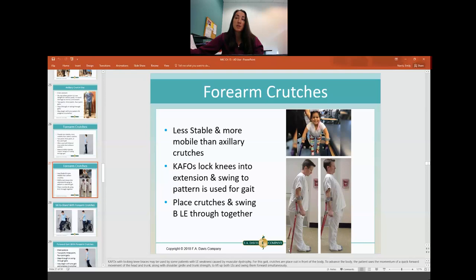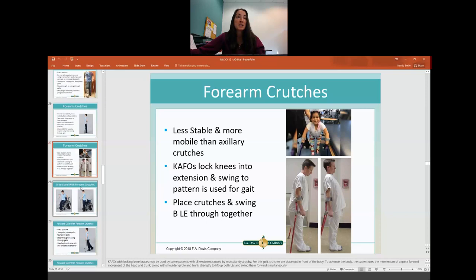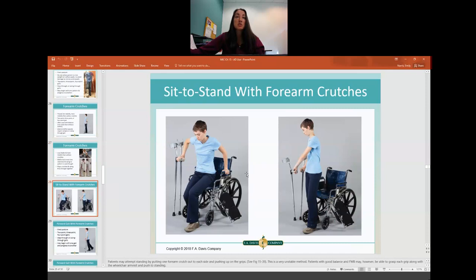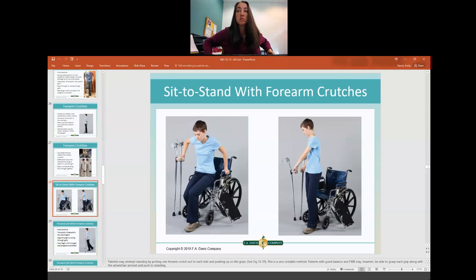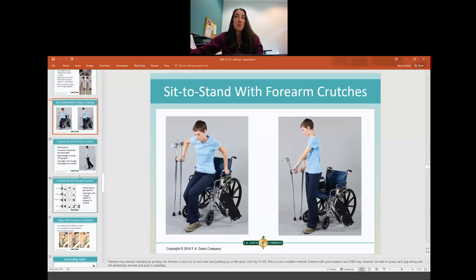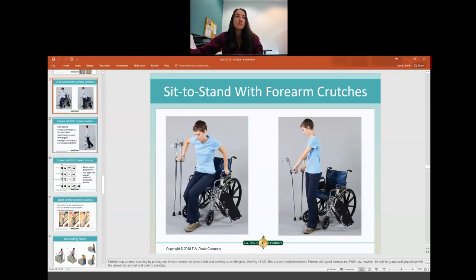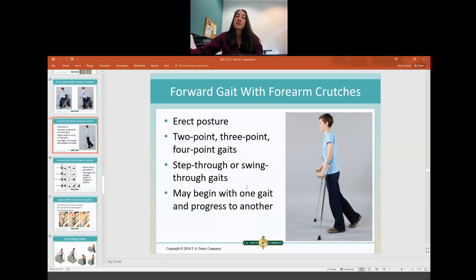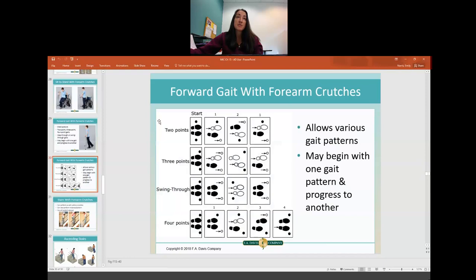With swing-to or swing-through gait, you set the crutches on the ground ahead, jump through, then lean back to stabilize yourself while moving the crutches forward. It is an advanced mobility move and may take a lot of practice for someone new at it. To stand with forearm crutches, you can place both on one side and use one armrest plus the crutches to push up. Some patients will have one on each side and use them to push up — if they've been doing that for years, don't teach them differently, but for new patients, teach with both on one side.